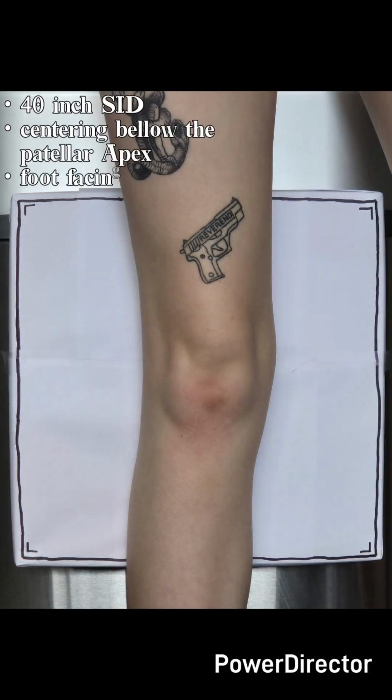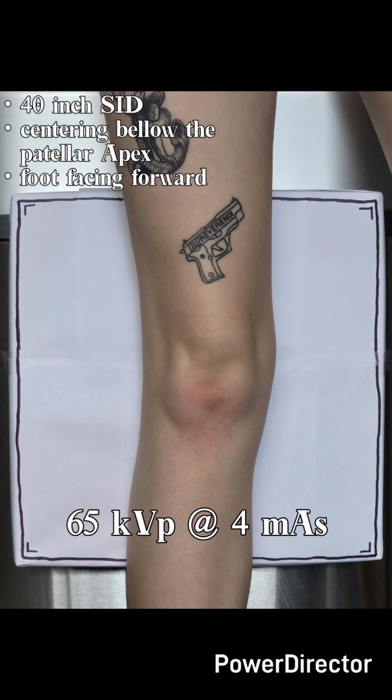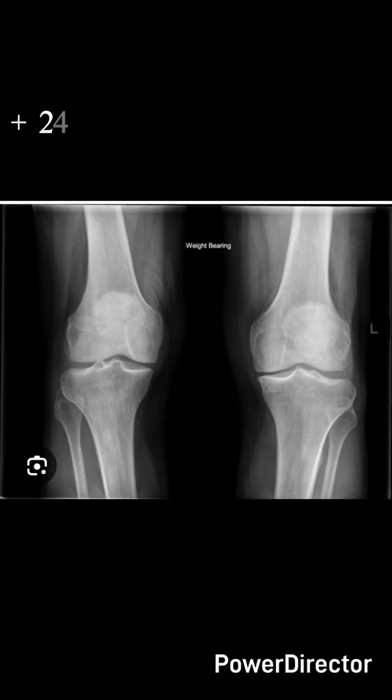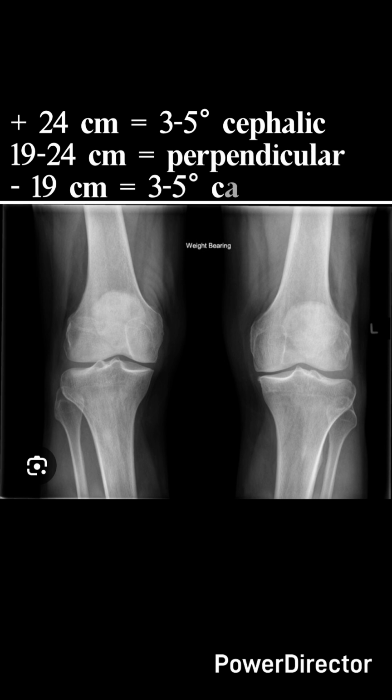You're going to center 1.5 centimeters below the patellar apex, which on me is pointed out right here, and the patient's foot will be facing forward. On myself, I would use 65 kVp at 4 mAs, and this is what the x-ray looks like. And there are some notes up top about what to do about angles if the patient's pelvis is different sizes.